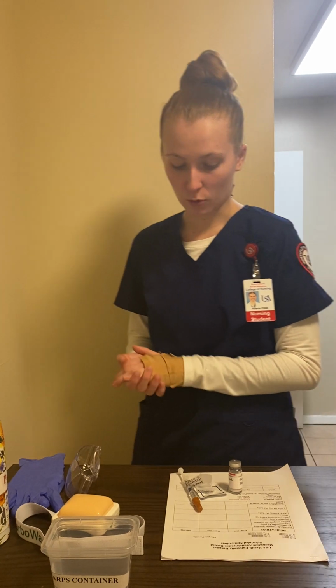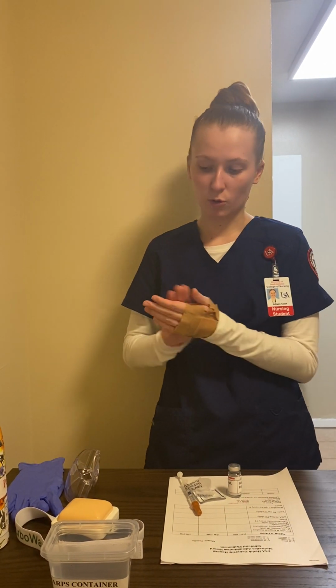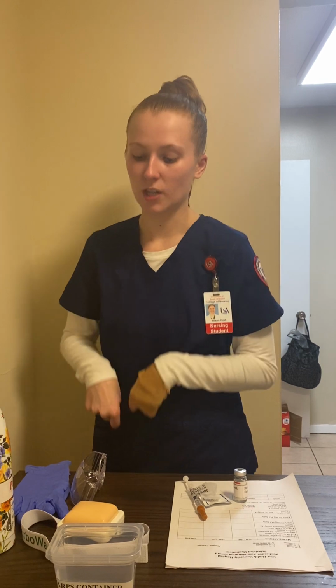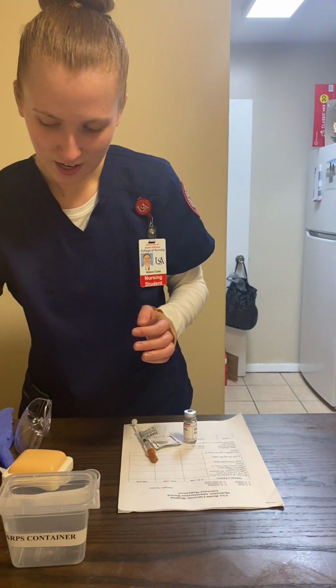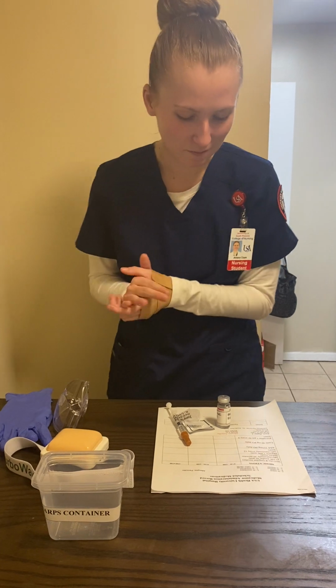So I'm going to go ahead and do a couple checks on you. First, I'm going to perform hand hygiene, and I'm going to raise the bed to a level where it's comfortable for me to work at, and I'm going to lower the side rail. If I could see your wristband, this is the armbands, which obviously, okay, anyways.